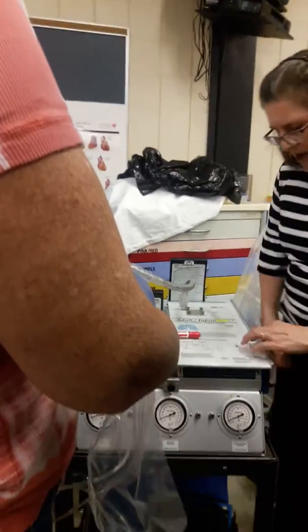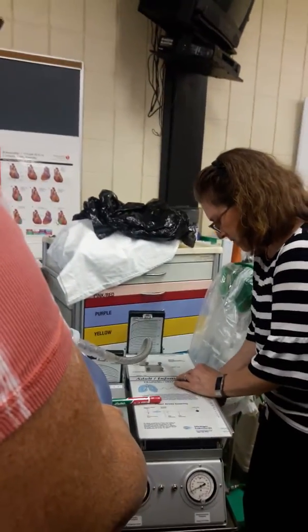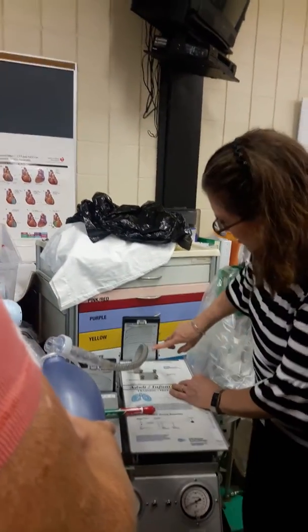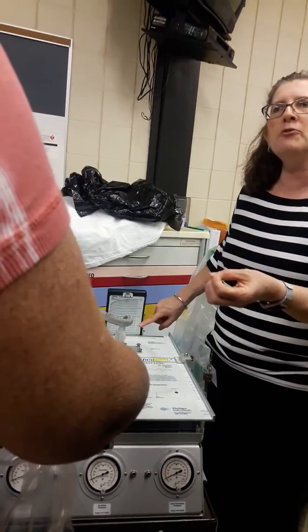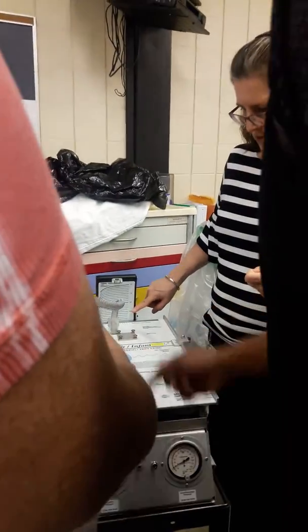Now I'm going to change this. I still want you to go to the 500 and hold the breath. What's your plateau pressure? Hold it, look at your plateau pressure. 35. Do you feel the difference? It takes more pressure to get to 500. So that's a less compliant lung. We'll calculate it out in a second.